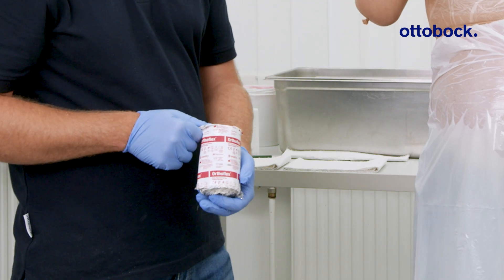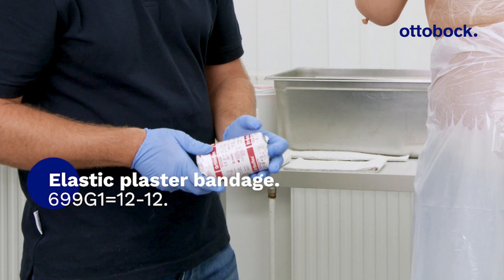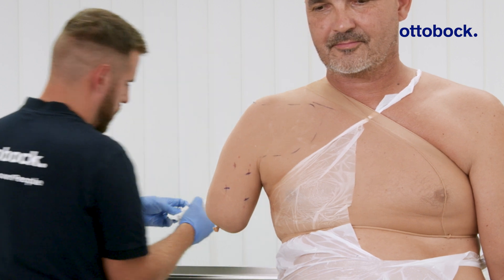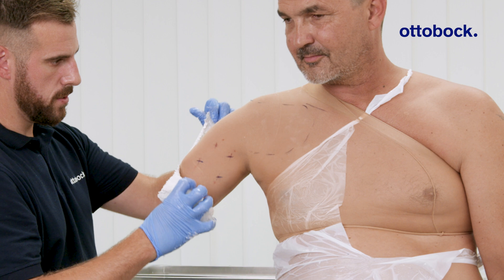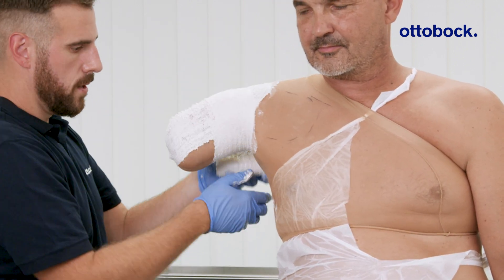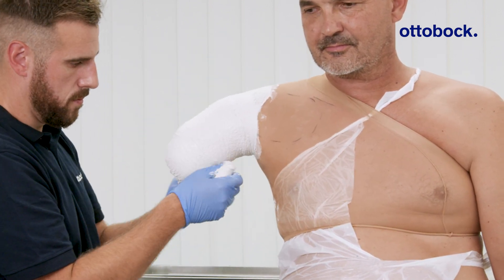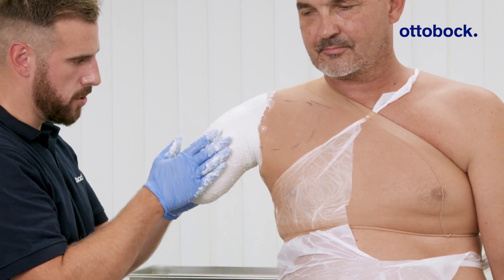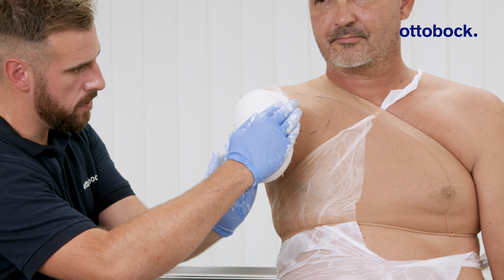Wrap the residual limb with an elastic plaster bandage to capture its volume. To mold the axillary region accurately, adduct the arm, then guide it forward and backward.